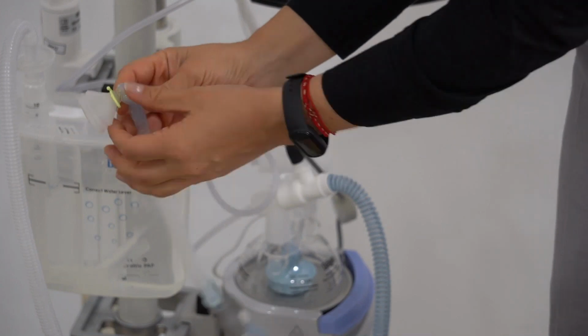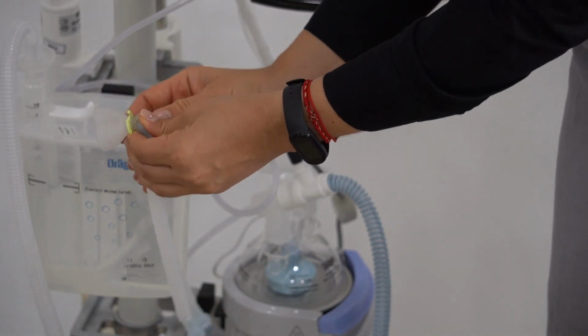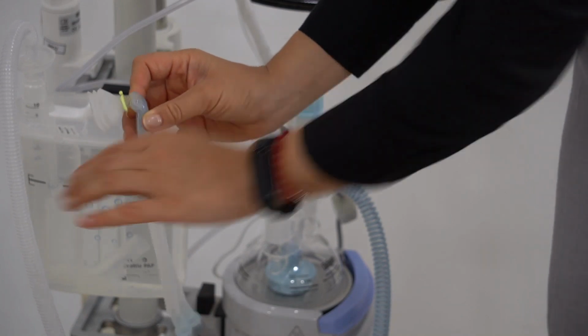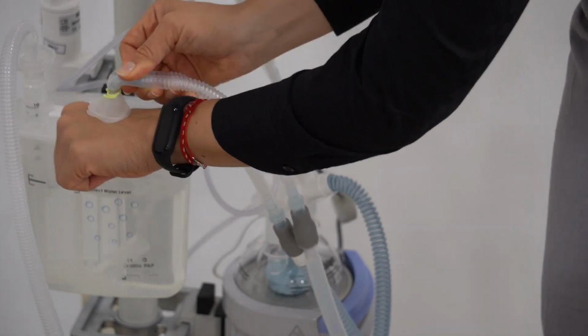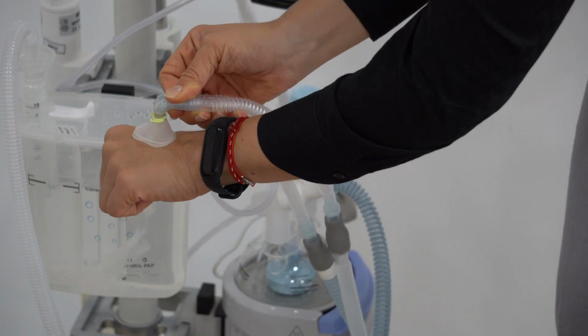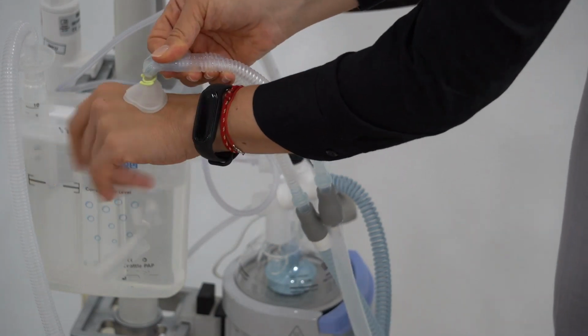This is the mask made of silicone with this special positioning aid. Now, when we position the mask, we don't have to fit it very tightly. If we do it too tightly, there's going to be even a vacuum.